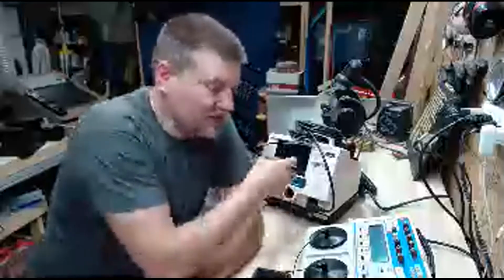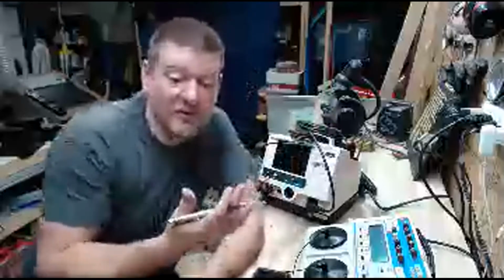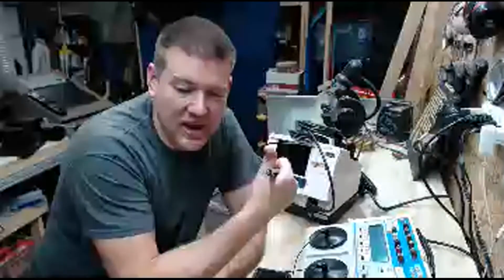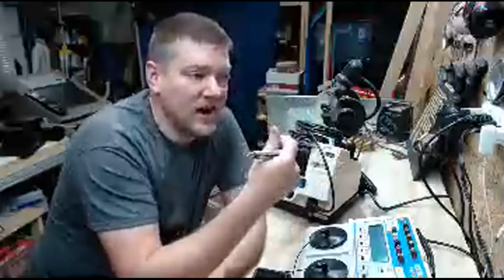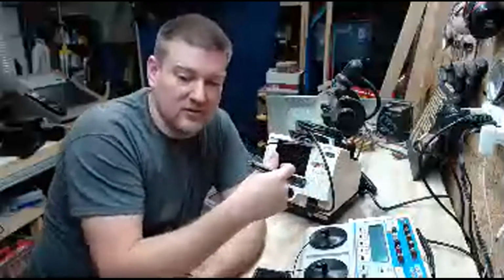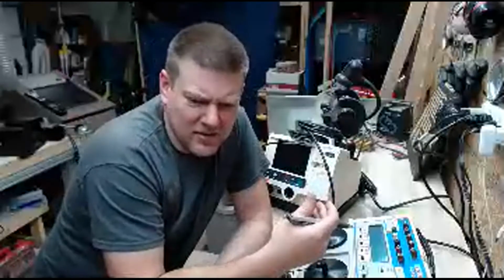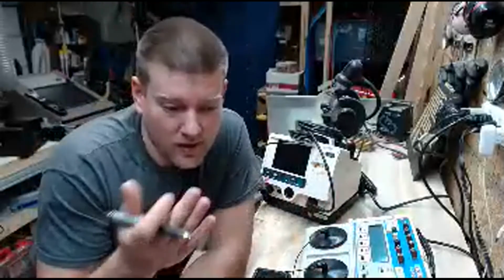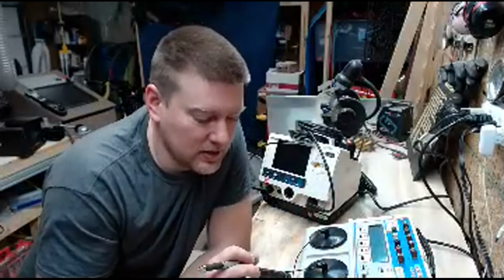And this is just a defib. It just does a time server, but it still connects to the network. So that means it has to have MAC address allotment in the network. It has to have an IP address, whether dynamic or static. A lot of devices do. So it's the future, guys. Medical networking, and there's not so many people that do it.